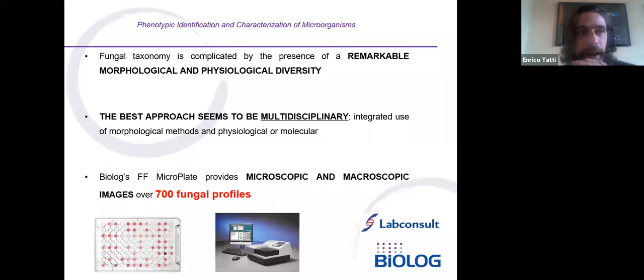But whoever has worked with fungi, as I was saying earlier, knows very well that fungi identification is not as straightforward as bacterial one. It's actually much more complex. Anybody that works with fungal identification more often does not rely on only one single identification method, but tries to use different identification methods to confirm and reinforce their ID, especially when this ID is crucial, for example, in QC microbiology, in food or in pharma, or even agriculture, as you can imagine.